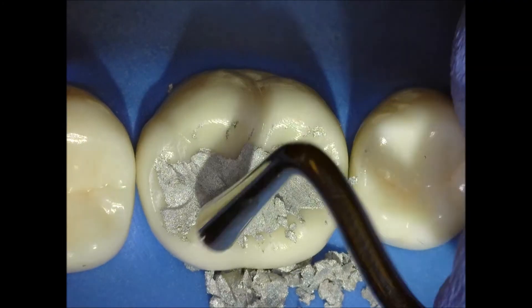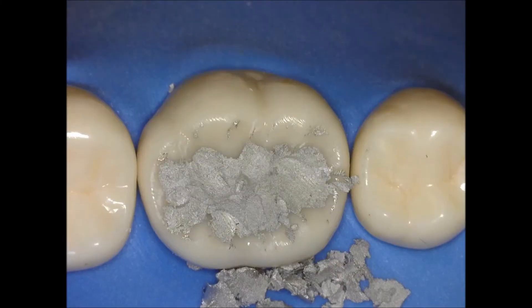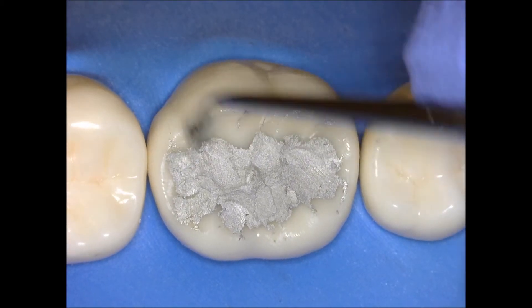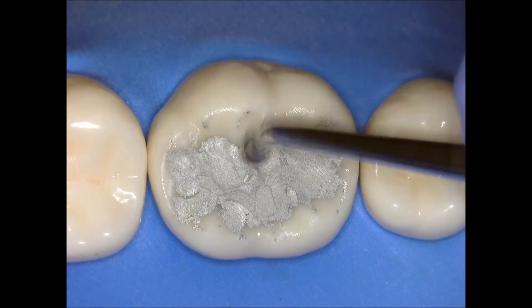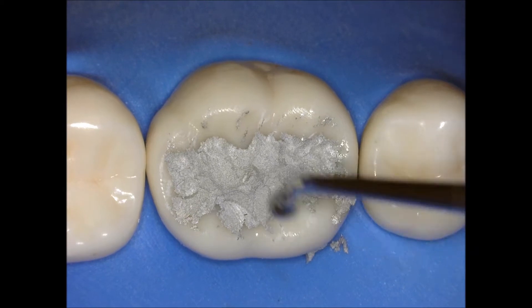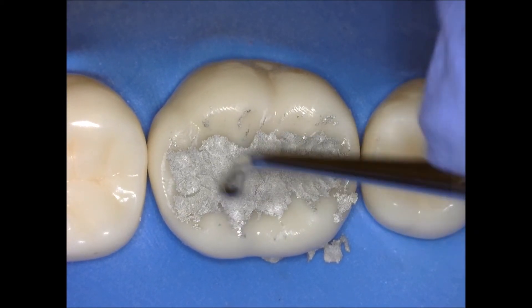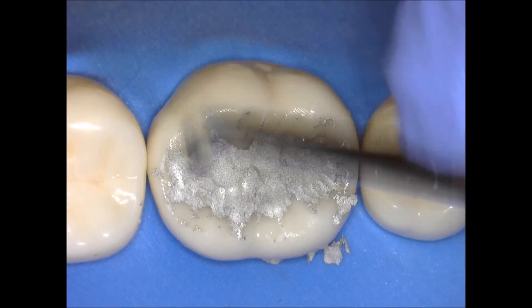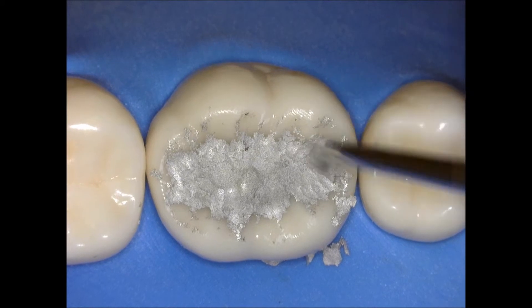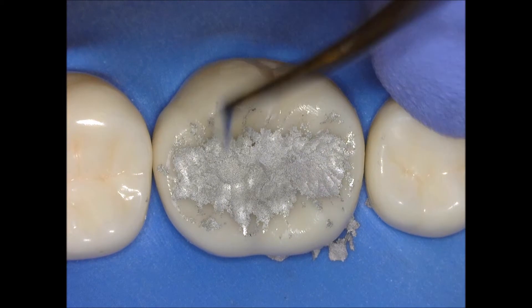This is a very important step — some people do it with a burnisher as well. This is called the pre-burnish. I'm using the ball burnisher and going over the cavosurface margin just to make sure it is flush and to remove some of the excess. I usually go over twice and only go over the cavosurface margin. If you notice, I don't touch the occlusal table.